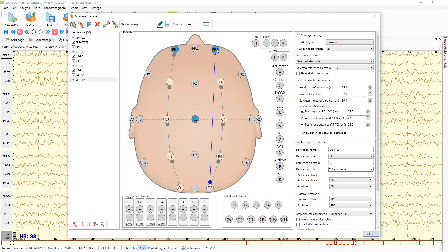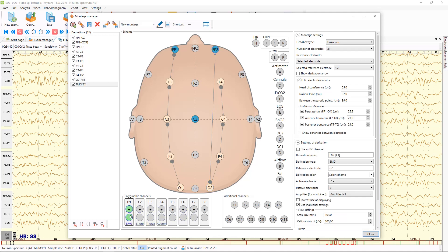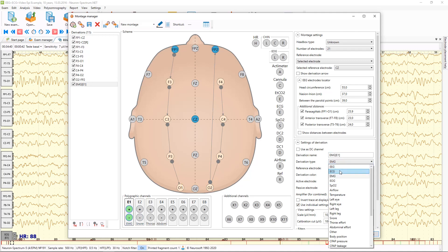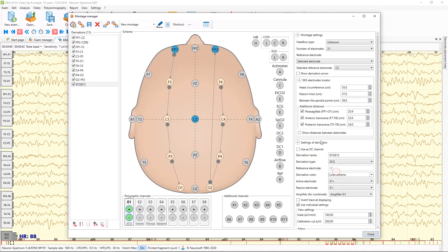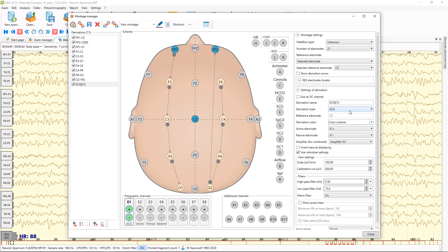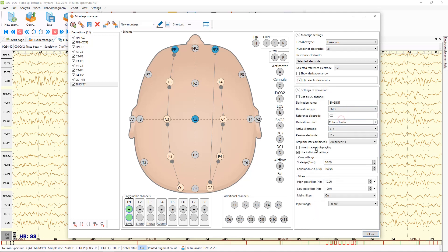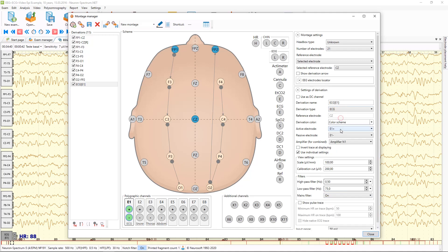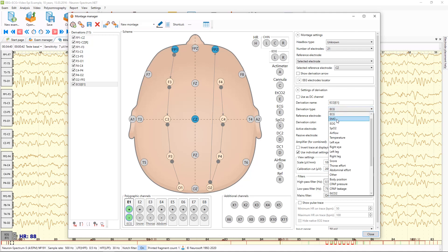Now we have bipolar channels. Also here you can use different polygraphic channels of your machine — for example, you can add EMG or set it as an ECG channel. When you do this, you can see that all settings of this channel are changed; for example, for ECG we use different scales and filters than for an EMG channel.